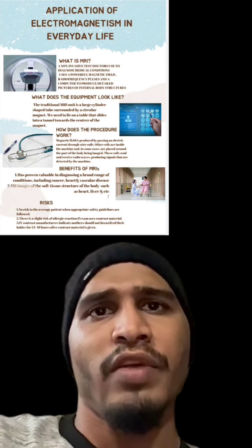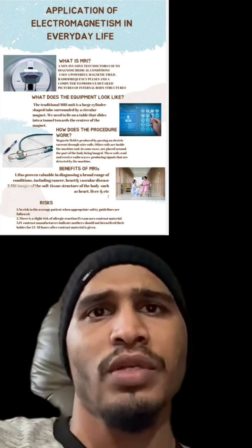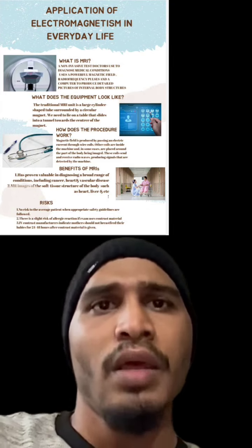Pregnancy: while no effects have been demonstrated on the fetus, it is recommended that MRI scans be avoided as a precaution, especially in the first trimester of pregnancy when the fetal organs are being formed, and a contrast agent, if used, could enter the fetal bloodstream.